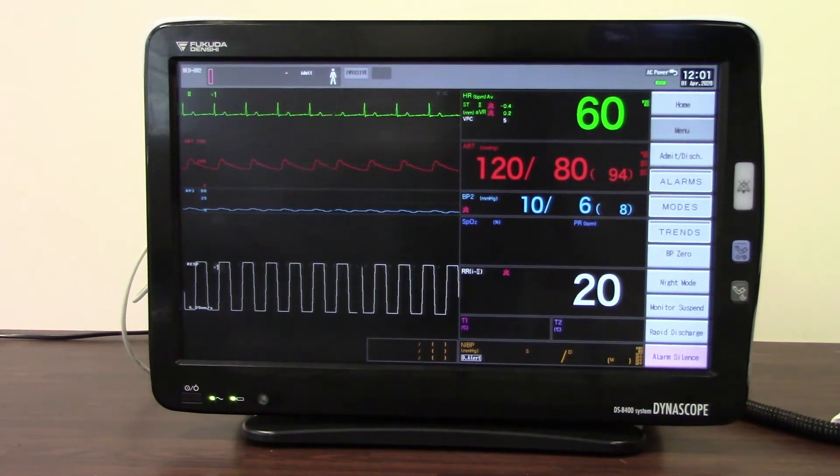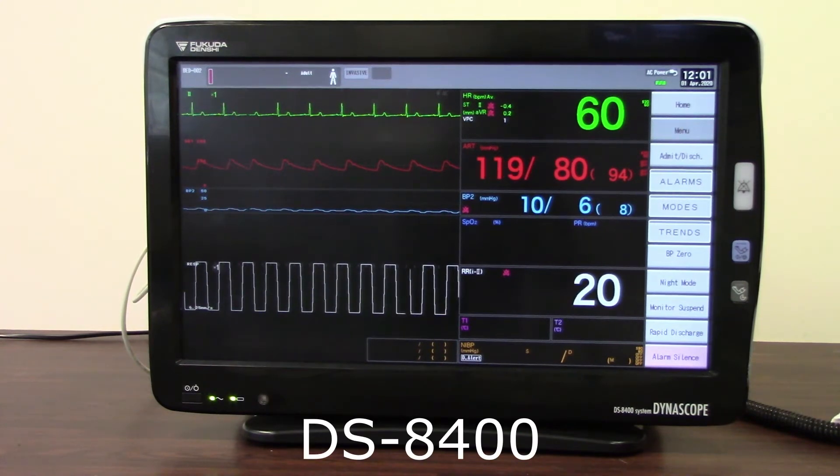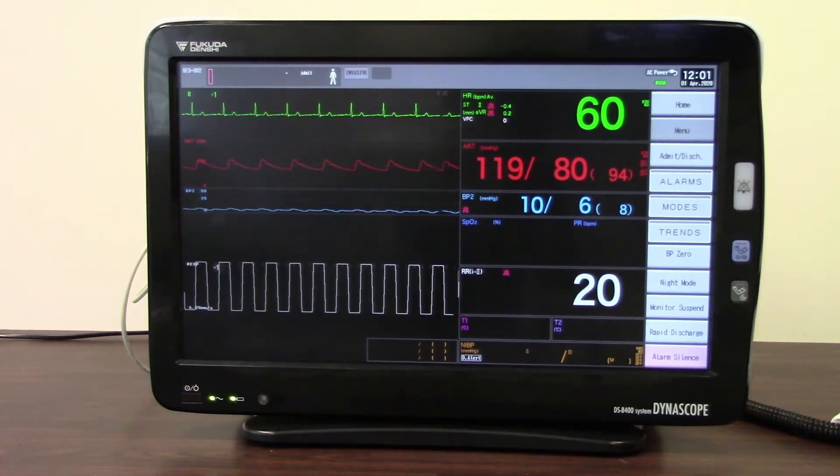Welcome to this short video training session for the Dynascope DS8400 monitor. This training session will demonstrate the alarm functions within the monitor. To begin with, we are going to have a look at and listen to some of the alarm sounds that the monitor makes when a particular alarm condition occurs.